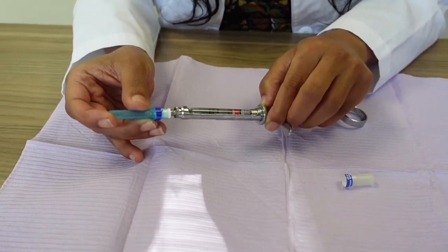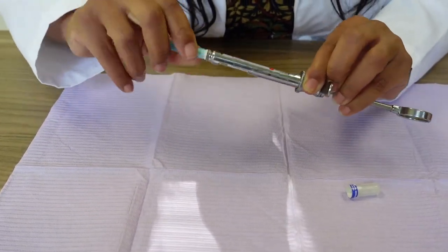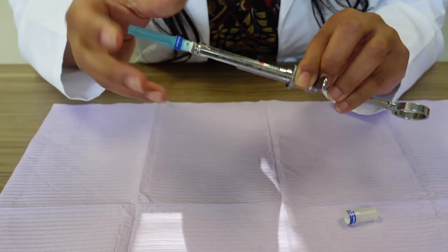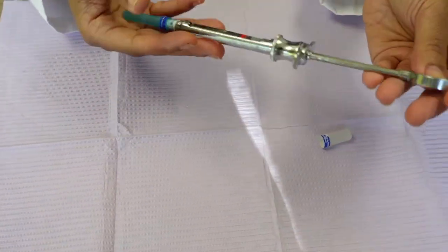You're going to push it in all the way, tighten it up. Make sure it's tight. There we go! That's how you set up an aspirating syringe. And when you hand it to the doctor, this is how you hand it to the doctor.